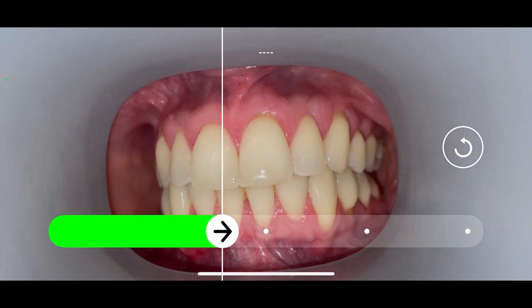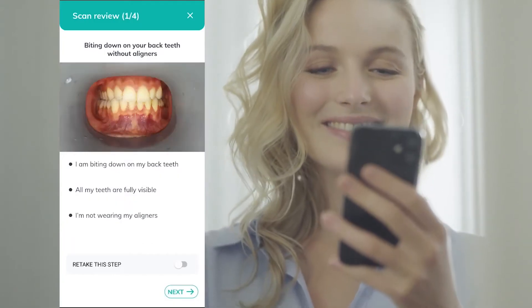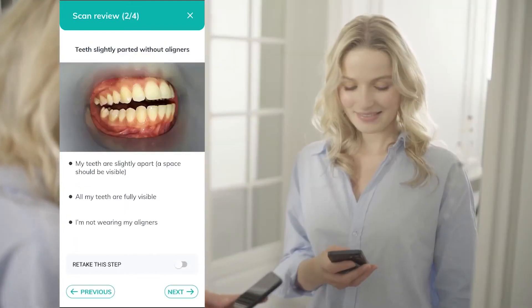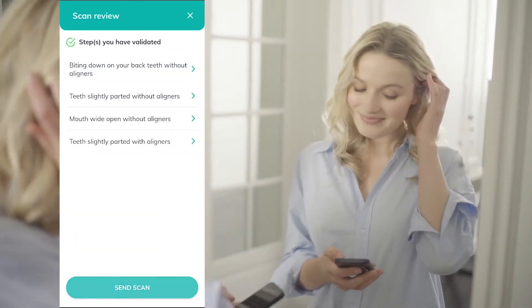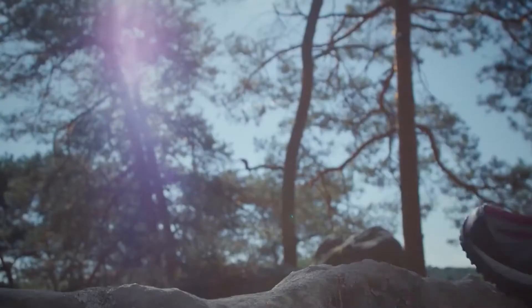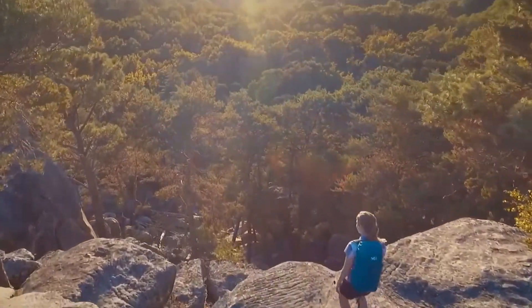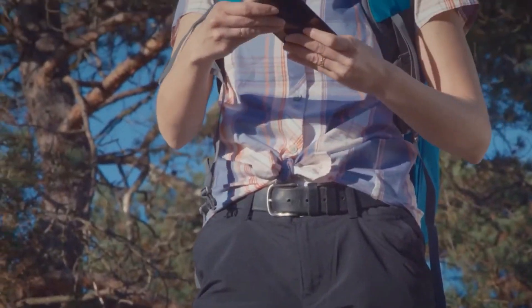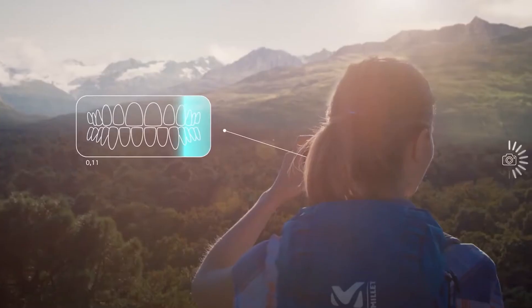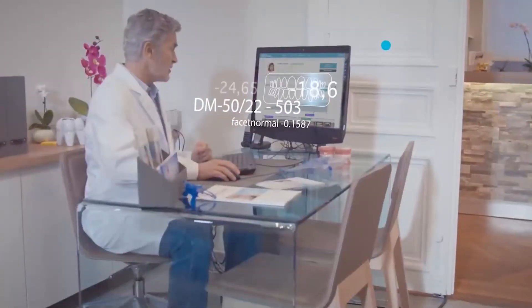Each clear aligner package includes the Dental Monitoring app and Scan Box Pro. Using the Scan Box Pro plus a smartphone, patients are able to take intraoral images from anywhere, straight into the Dental Monitoring patient app. From here, RACE Dental's orthodontic team can assess, qualify, triage, and monitor your patients' treatment remotely. The AI in the Dental Monitoring solution analyzes the fit of the aligners, ensuring compliance and that the move from one aligner to the next stage is done at the right time.